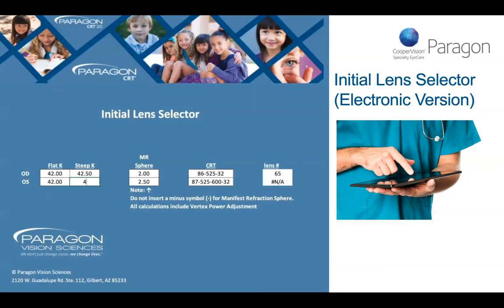Depending on the corneal toricity between the flat and steep K, you may have a CRT lens, or if there's greater than 3/4 of a diopter of corneal toricity, the calculator will recommend a dual axis lens. Here in the circle are the parameters that we will want to start off with.